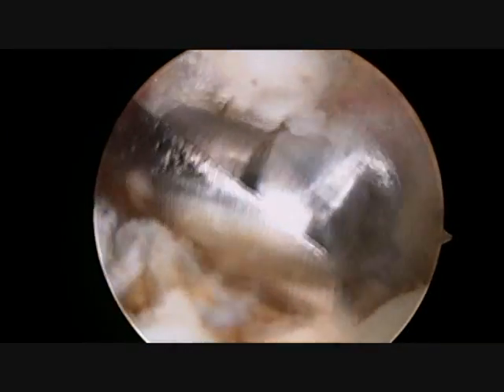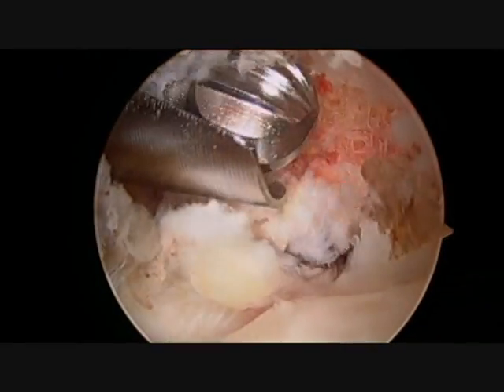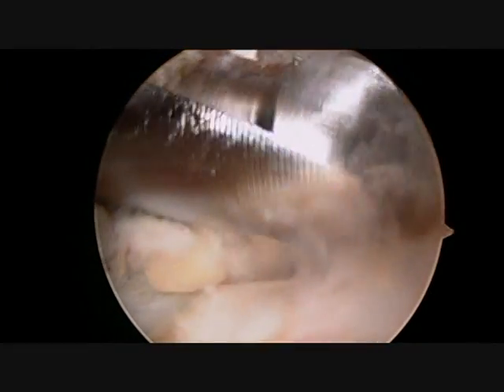When all of the spurs are removed, the amount of bone resection can be gauged and the remaining portion of the clavicle can be excised in a sequential manner, from the front to the back. It is important to carefully remove the bone in order to obtain the proper amount of resection.